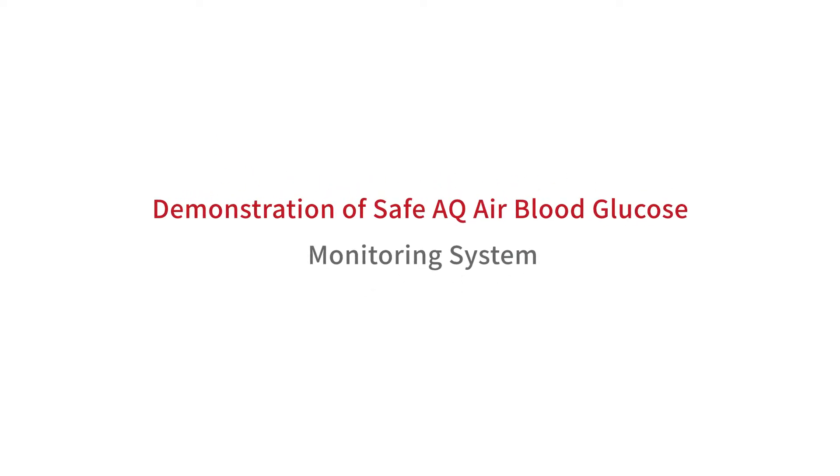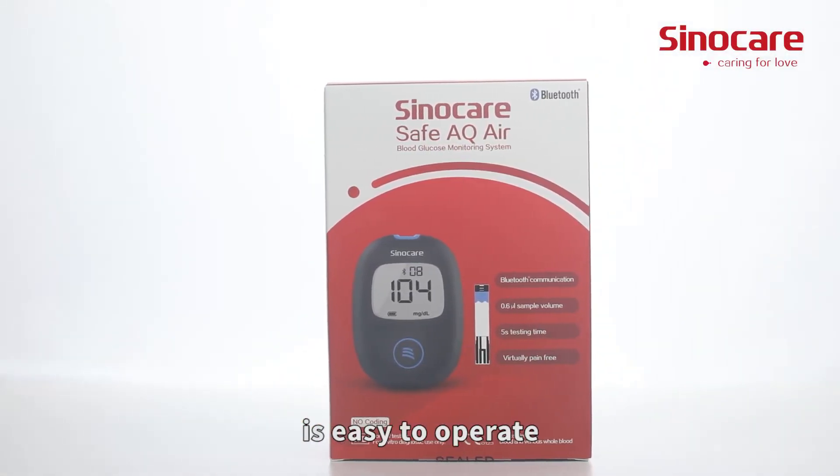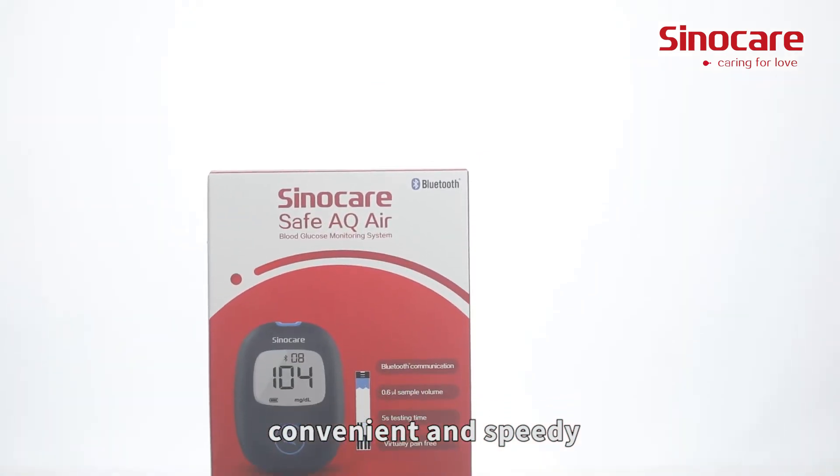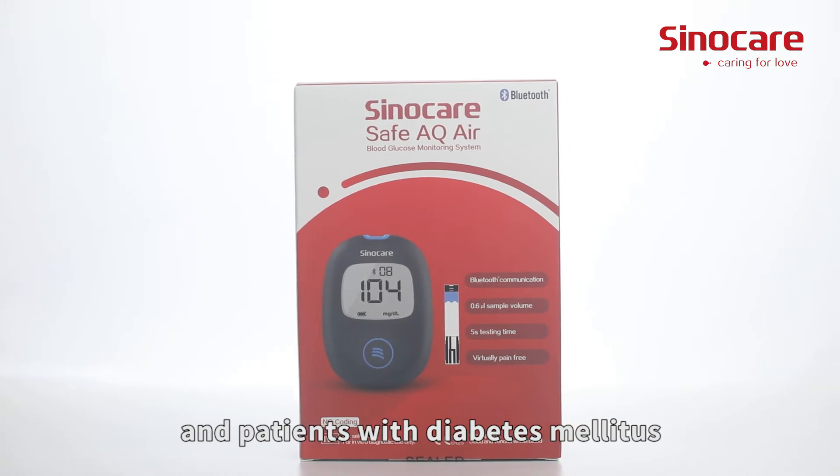Demonstration of SafeAQ Air Blood Glucose Monitoring System. The SafeAQ Air Blood Glucose Monitoring System is easy to operate, convenient, and speedy. It can be applied to medical organizations and patients with diabetes.